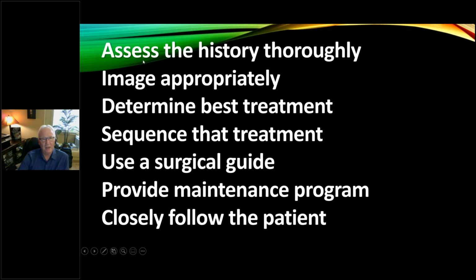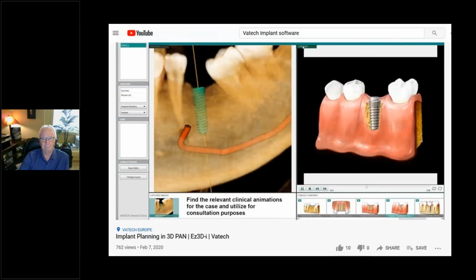So in closing, I want you to assess the history, image appropriately, determine the best treatment, sequence that treatment, use a surgical guide, provide a maintenance program, closely follow the patient. And if you do all that, you'll have a very successful implant practice.